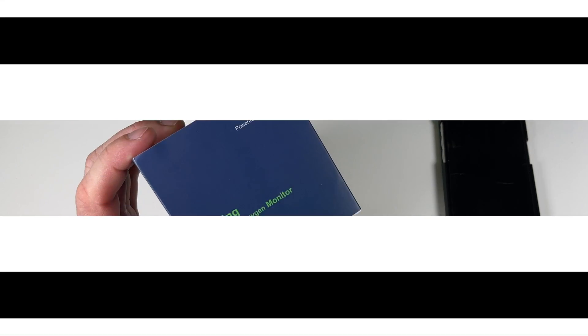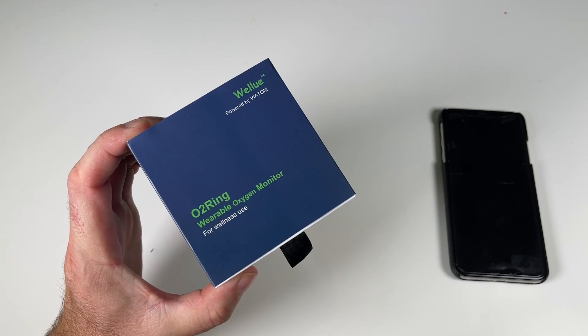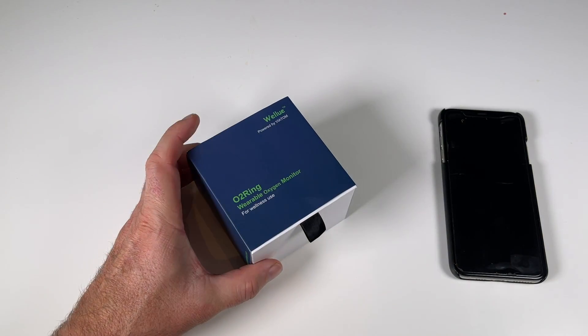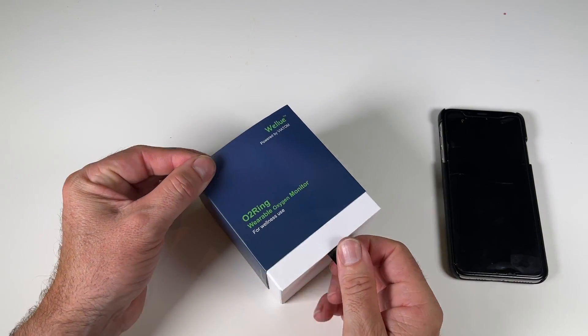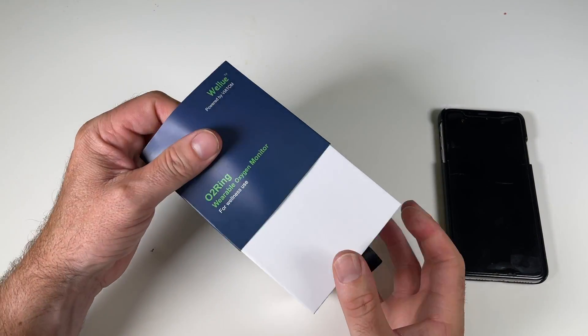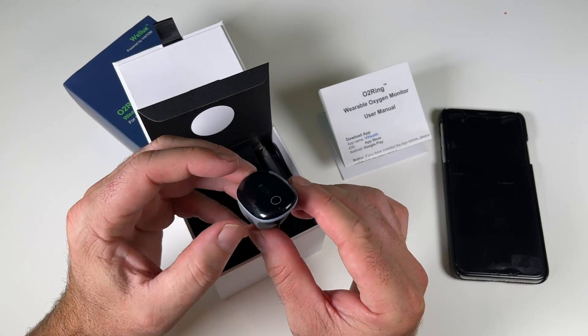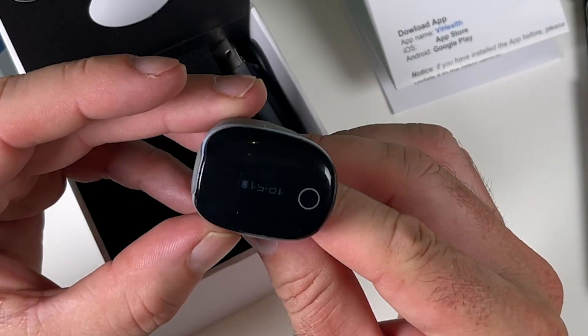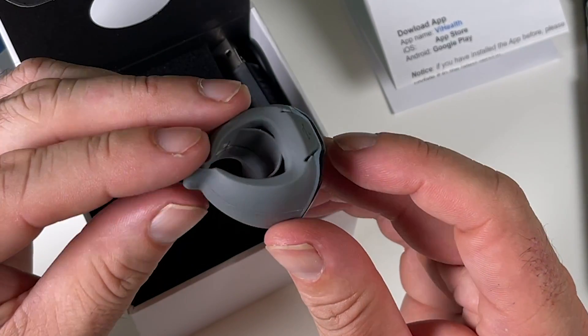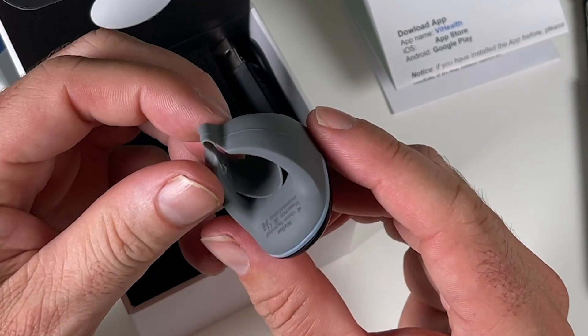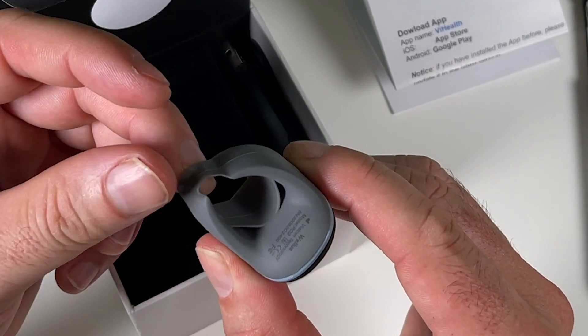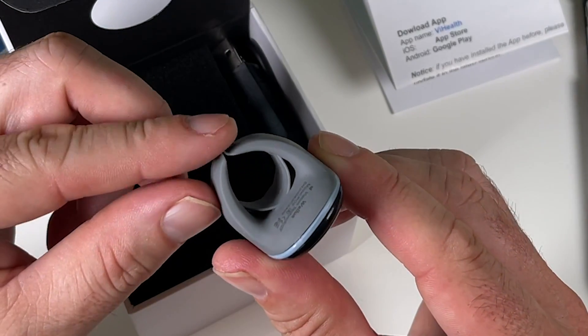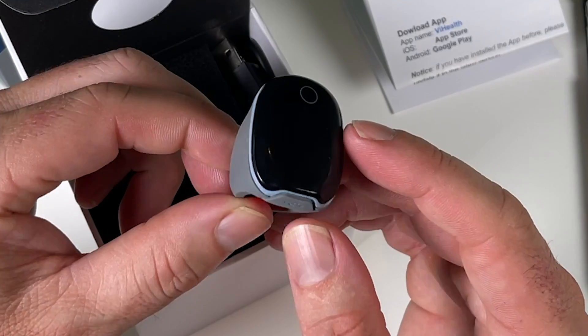Alrighty. So here we have it, the Wellu O2 ring. So I'll just do a quick unboxing for you so you can see it up close and personal. And then here's the little ring here. It's really comfortable to wear. It's really soft. You hardly even know you're wearing it.